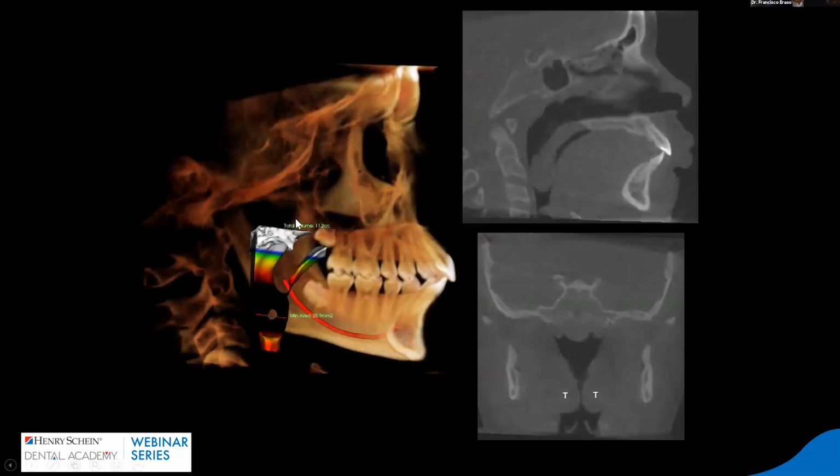And then you produce images, okay? The beauty of these images for this case is that then I say, okay, I think Santiago is having some airway issues, and I concentrate too much on that, okay? And look at, yes, of course, we're going to refer that to the ENT. The ENT is going to produce some of the changes. We are going to quantify that, okay?